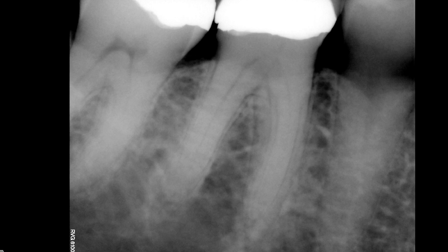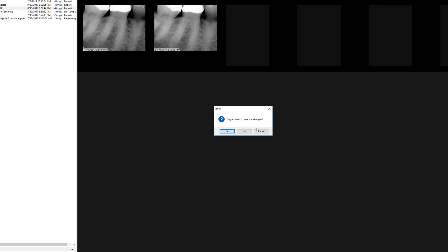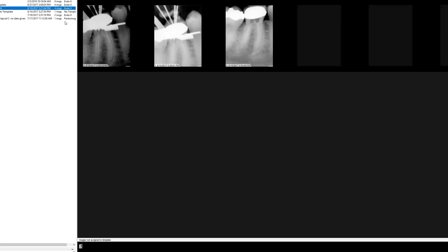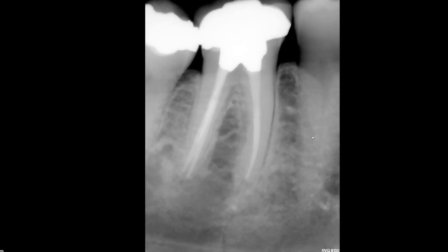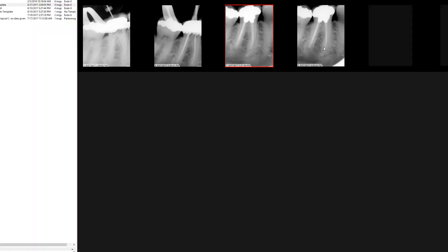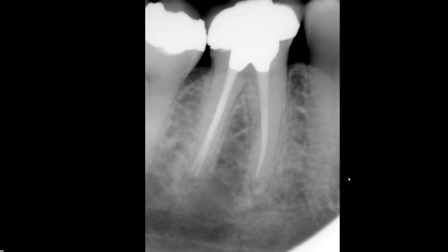Now I'm going to show you radiographs that were taken immediately after root canal therapy was completed. This was taken in September 2017 right after its completion. I'm going to show you another one — this is an immediate post-op radiograph from 2017.